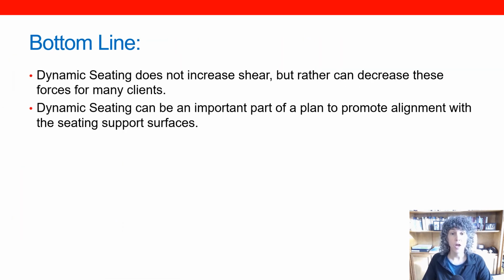So what's the bottom line? Well, dynamic seating does not increase shear. Rather, it can decrease shear forces for many of the clients who benefit from dynamic seating. And dynamic seating can be a really important part of an overall plan to help keep the client in alignment with the support surfaces without a loss of position.